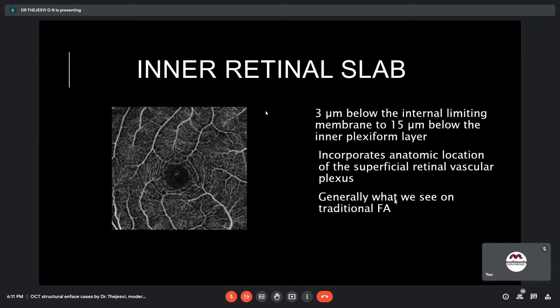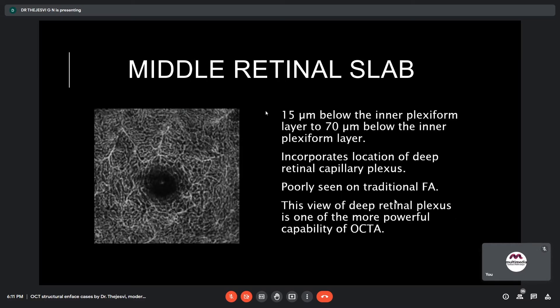The auto-segmentation for the inner retinal slab starts 3 microns below the internal limiting membrane to 15 microns below the inner plexiform layer, incorporating the anatomic location of the superficial retinal vascular plexus — generally what is seen on traditional FA. The deep capillary plexus slab starts 15 microns to 70 microns below the inner plexiform layer. This is poorly seen on traditional FA and is considered one of the most powerful capabilities of OCTA.